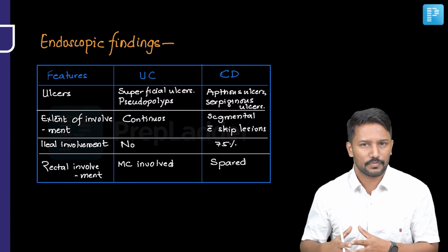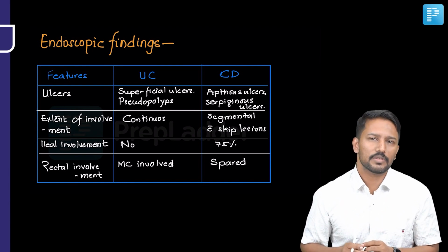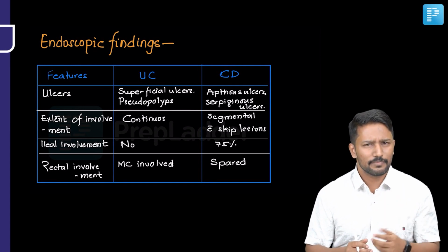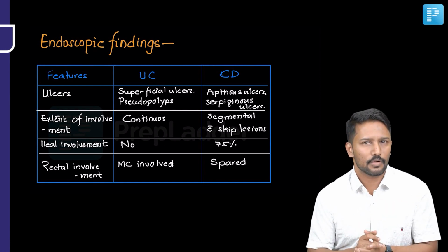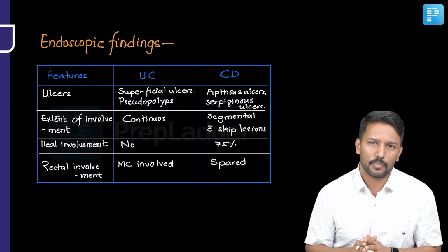For further evaluation of IBD, if you are thinking in this direction, your starting point is most likely going to be the endoscopic evaluation. Right? The barium studies and all are not that commonly performed, so you probably refer it to a gastroenterologist, and he will do a limited or a detailed colonoscopy, or maybe a sigmoidoscopy, and then he will take it forward from there if required into a complete colonoscopy.